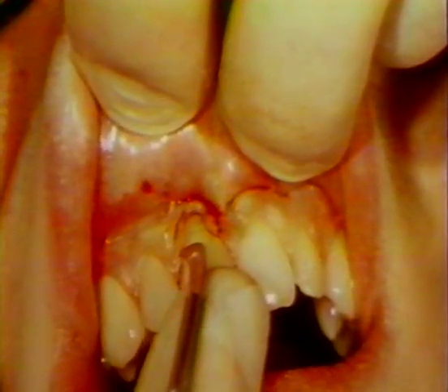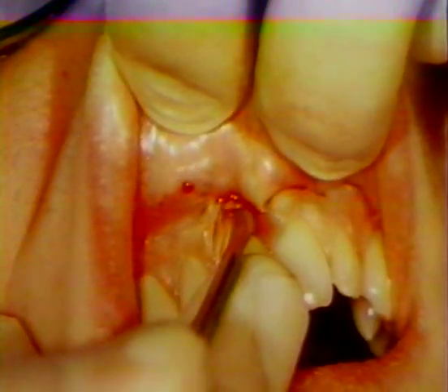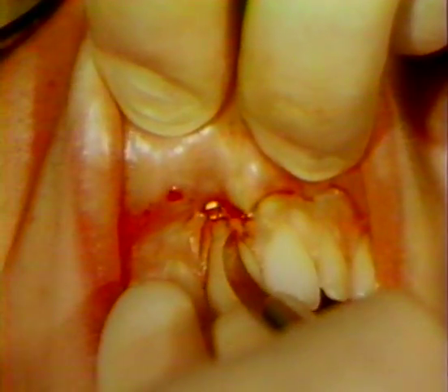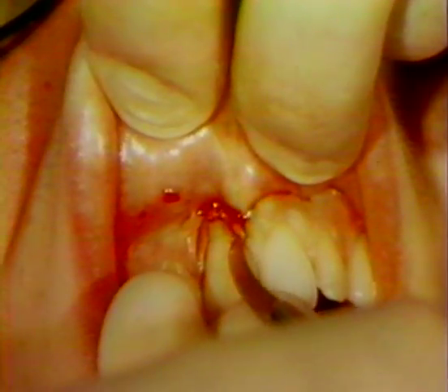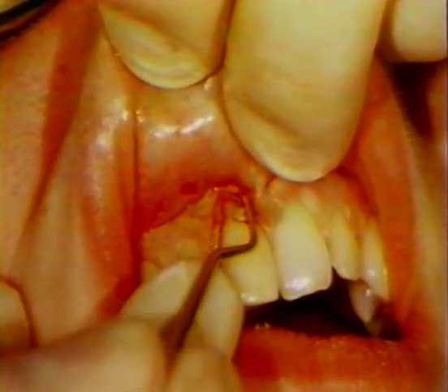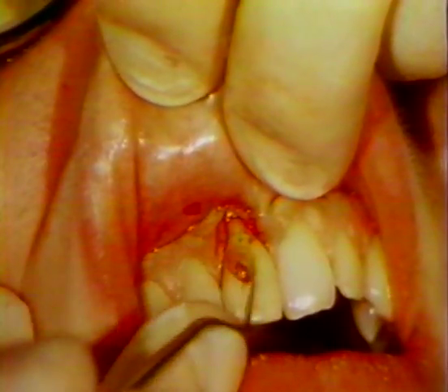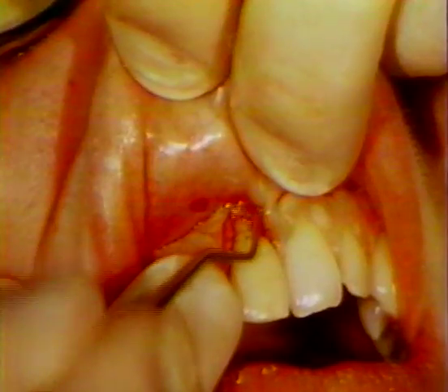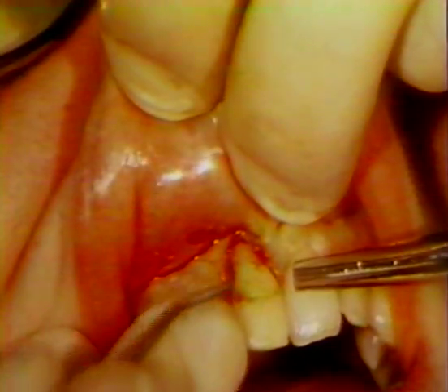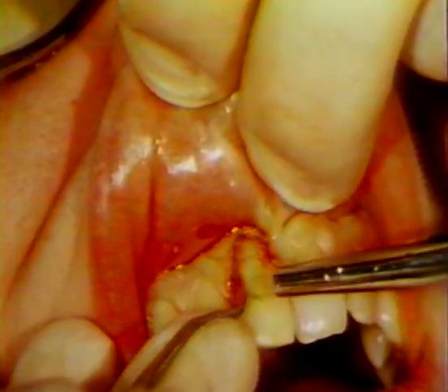A second incision is made along the labial surface of the tooth at the bottom of the gingival crevice. This separates the free gingiva from the tooth. The excised free gingiva is then removed with a curette and the bottom of the gingival crevice curetted to eliminate any remaining epithelial cells.